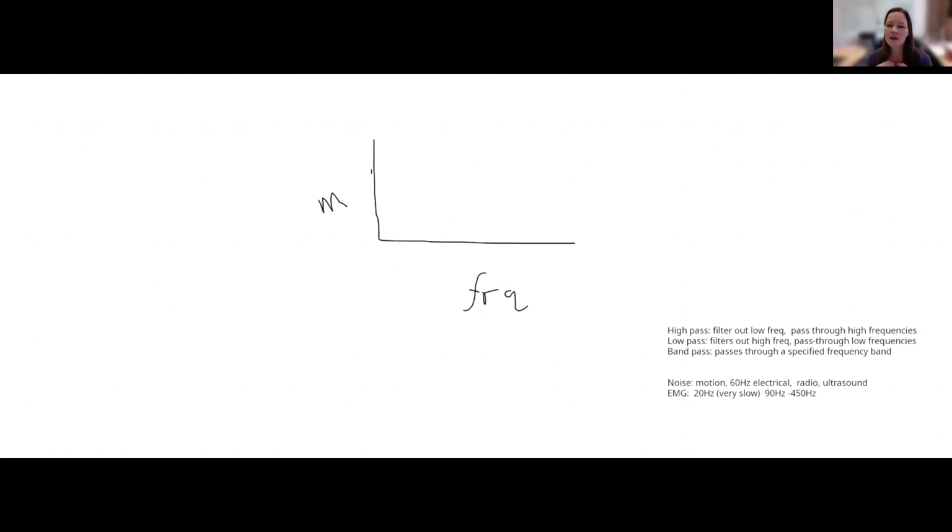So when we filter EMG, you need to know something about how the data was collected. And you need to know, for example, if there was already filtering in hardware, because there often is some, right? And so if there was some filtering in hardware, that might reduce the need for you to filter it in software, right? And you need to know your original sampling frequency.